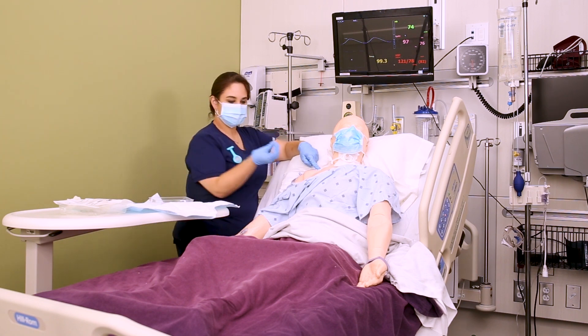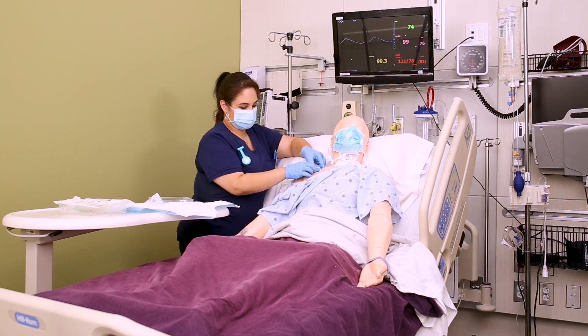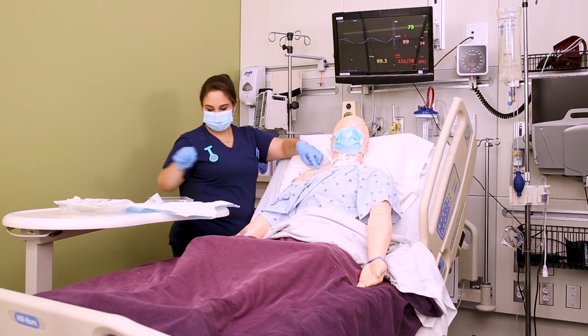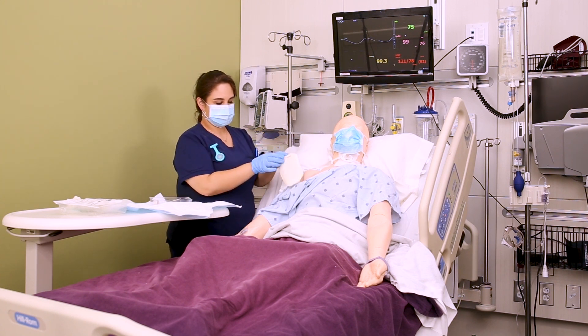Once the site is clean, apply your new bio patch. Most bio patches have a blue side — blue to the sky. Follow manufacturer instructions in case yours differs. Place the slit around the catheter and slide it under, but don't twist it too much or you risk pulling the catheter out.